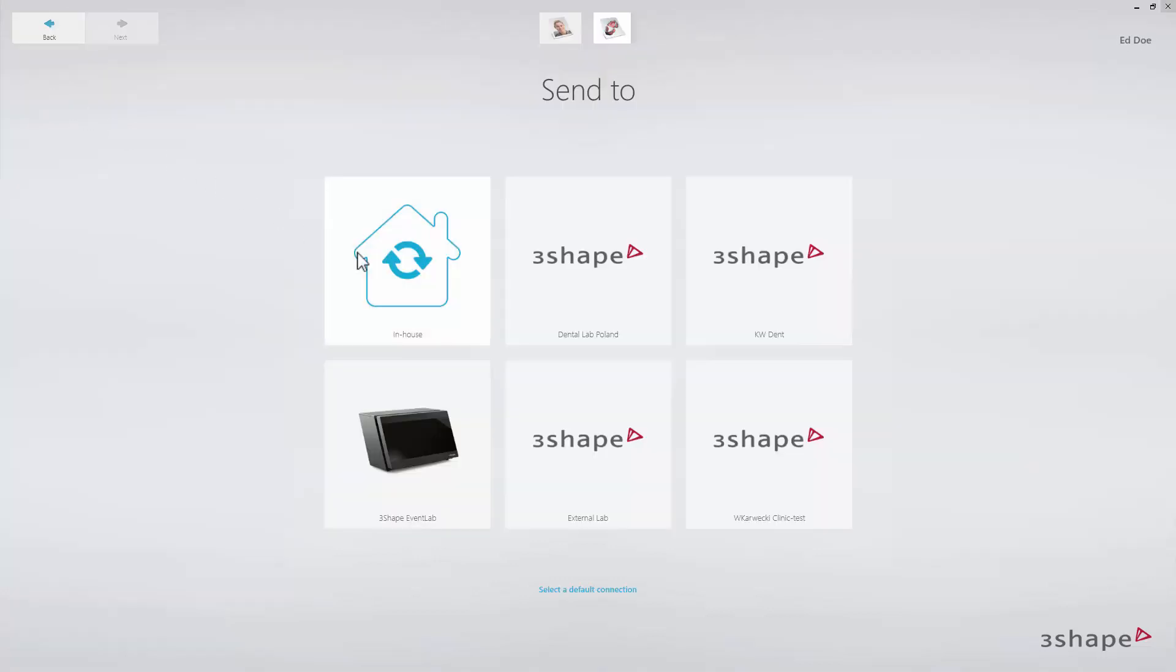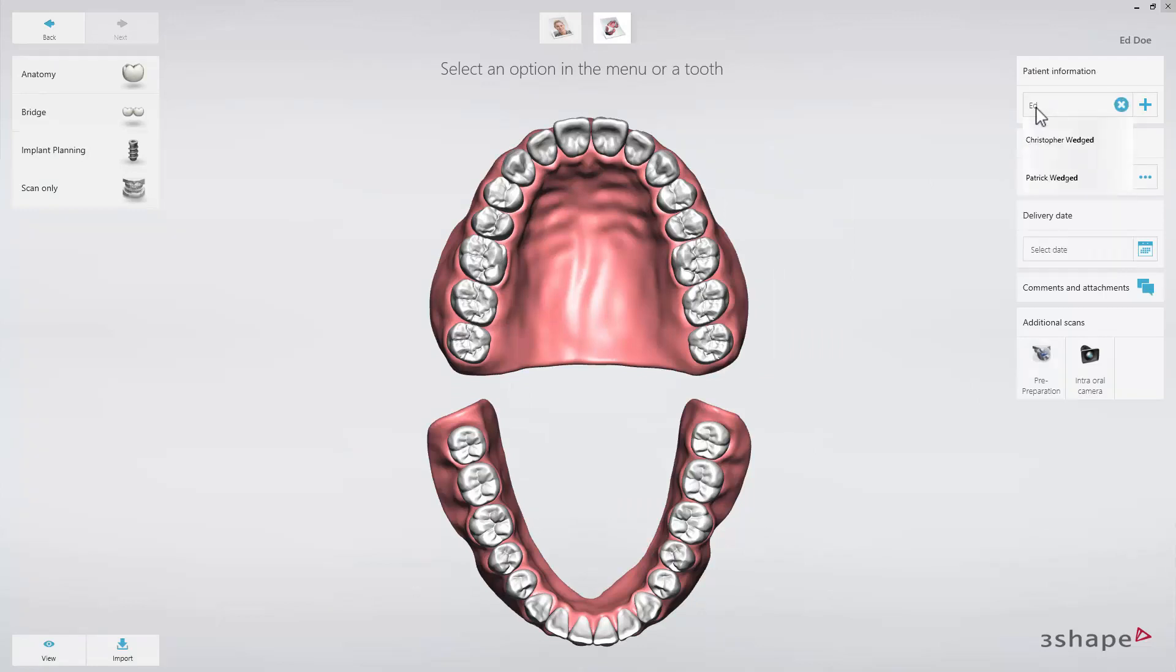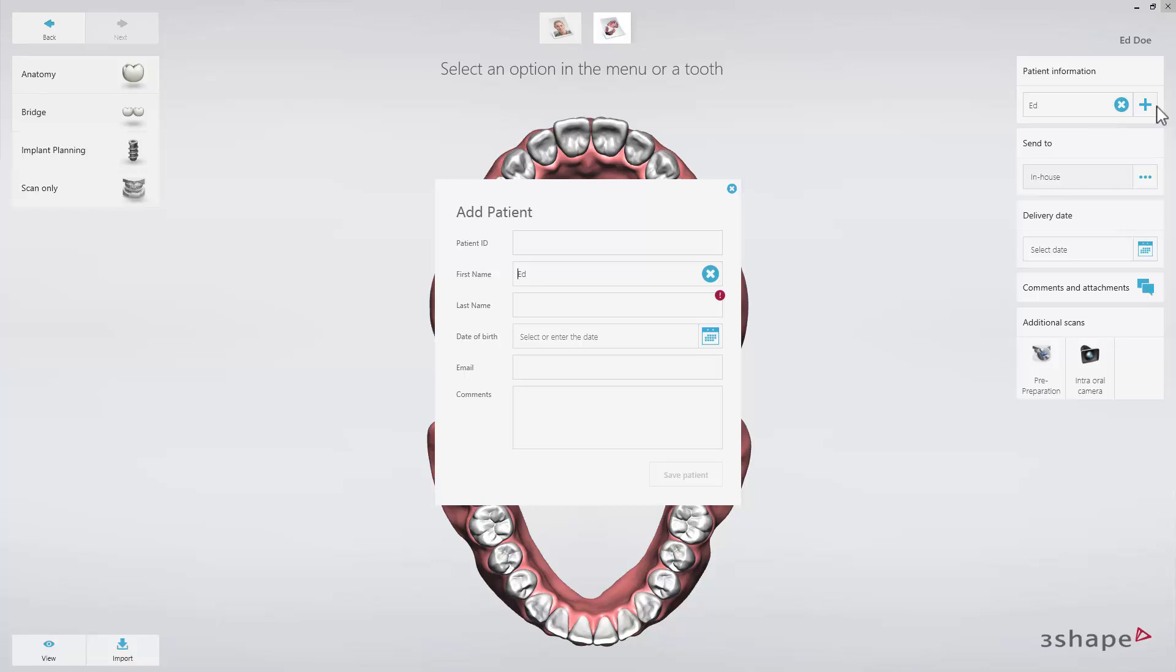In this case, we select to handle the case in-house. Search for an existing patient name or create a new patient name by clicking on the plus button.